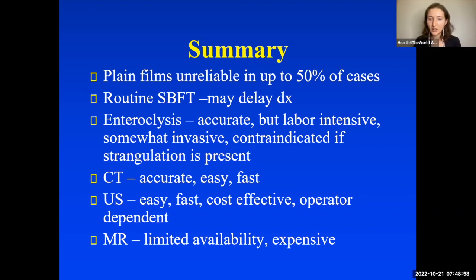Great. And I think there's another question coming in through the chat. The participant notes that at their institution, they do not use oral contrast in the ED, only IV. And often when obstruction is suggested on these exams, the surgeon wants to repeat with oral contrast, often within less than 24 hours. Is there a benefit in repeating with oral contrast, or would you recommend a small bowel series?